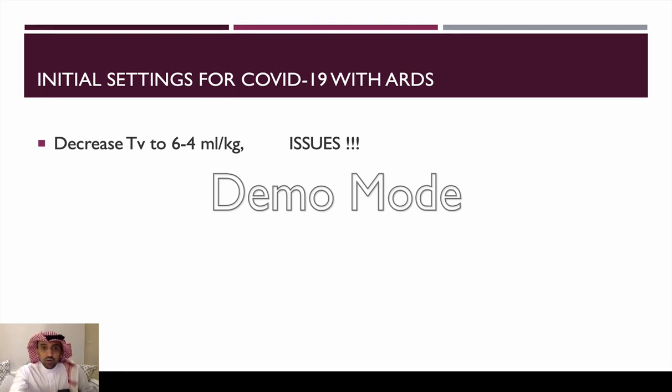As we know, let's go back to the minute ventilation. The minute ventilation is the tidal volume times the respiratory rate. So if you decrease the tidal volume, you may decrease the minute ventilation, and you will have buildup of carbon dioxide. So how to overcome this issue?